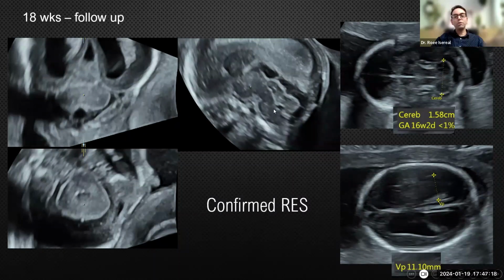And when we perform an exact mid-sagittal image of the midbrain, hindbrain, you can see here there are no Vermian fissures. There is no vermis because we are crossing exactly through the rhombencephalon, through the cerebellum. So this is a classic appearance of rhombencephalosynapsis.